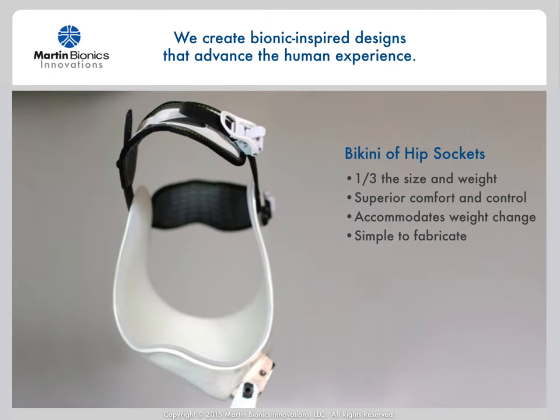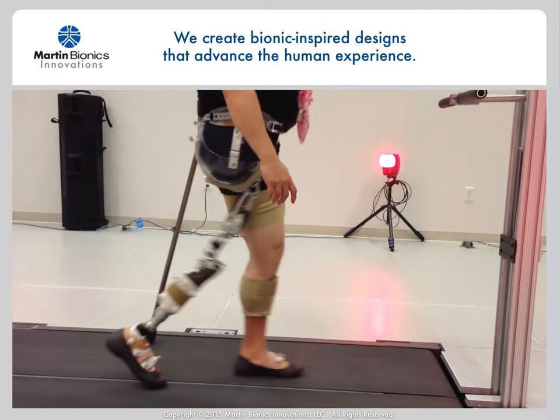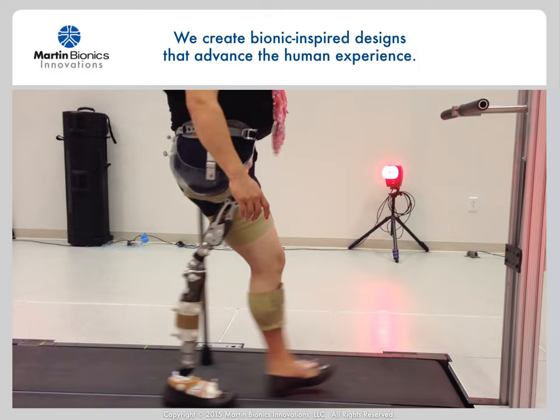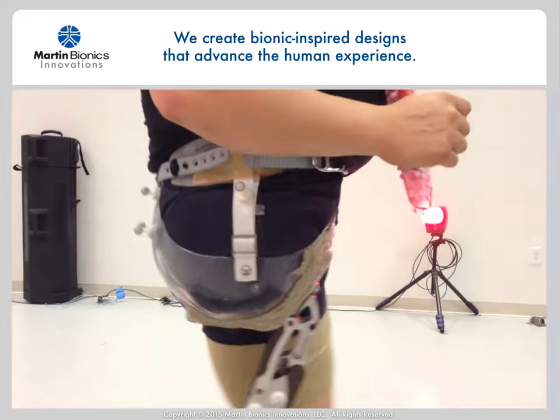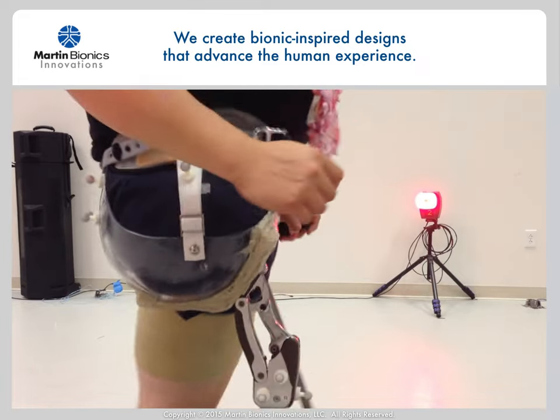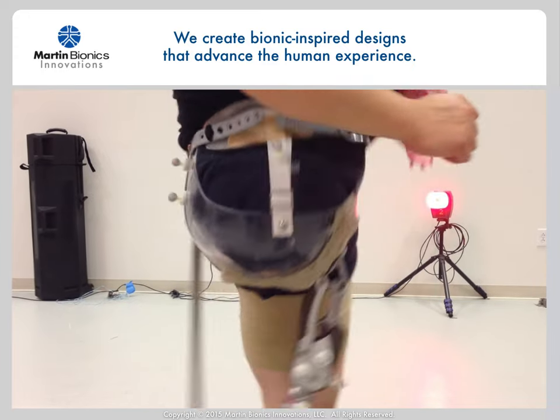Let me share with you briefly about our bikini hip socket design. This design is equally as simple to fit and fabricate as the fabric shoulder socket for upper extremity, and its design revolutionizes life for people with that challenging level of amputation. This design is less than a third of the size and weight of conventional hip sockets and offers far greater control and comfort than any other hip or hemipelvectomy level socket design. If you are not already trained in how to fit the bikini socket design, I can provide DVD or in-person training on it as well, and I'm happy to be a resource for you in any of your hip or hemipelvectomy level fittings, even if it's just to answer questions as needed.